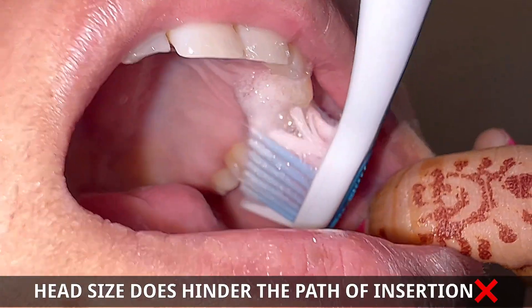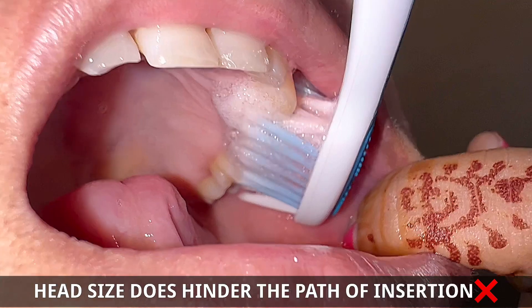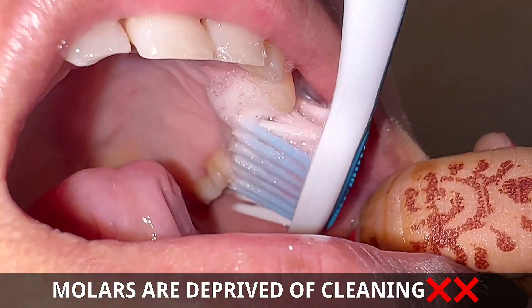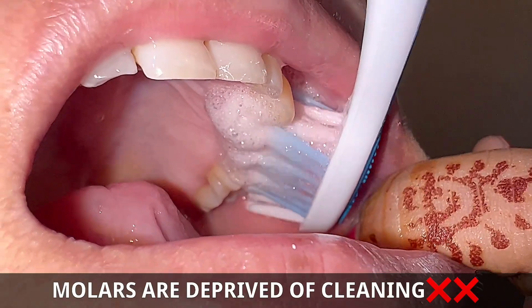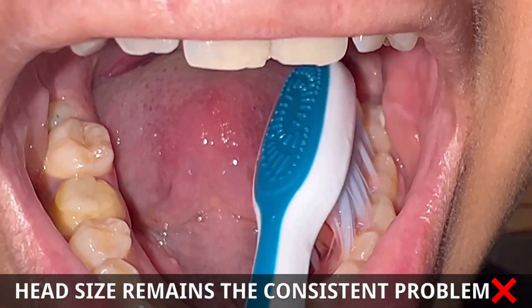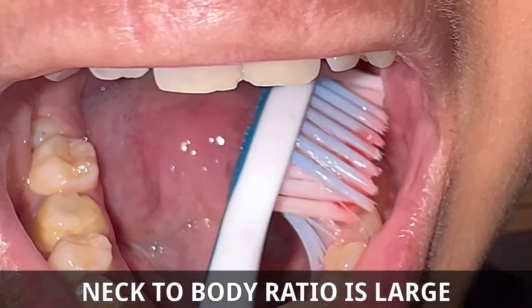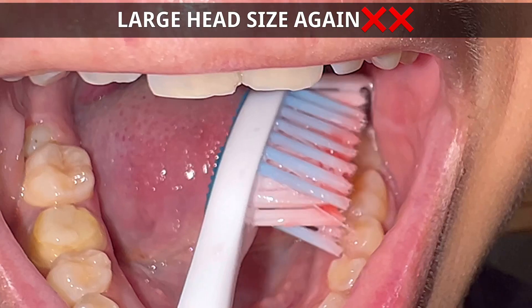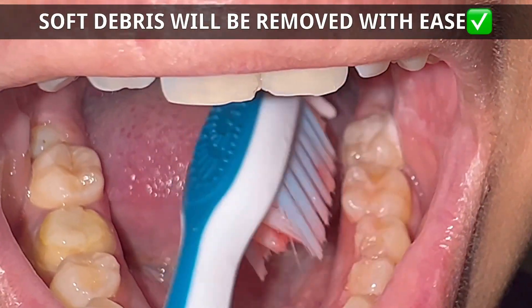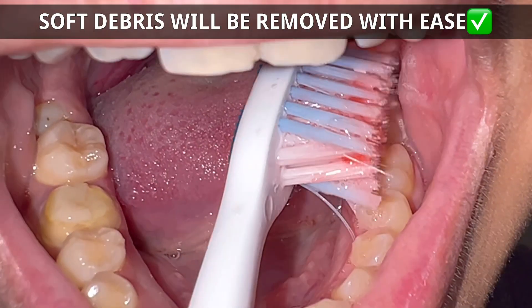Maybe it is because of a design flaw — the head size is very large. She is performing the modified Bass technique and the bristles are doing their job very well. But again, the molars are left out. The issue with the lower arch remains the same: the head size is very large, the neck-to-body ratio is again large, and as a result half of the oral cavity is covered with the head size.